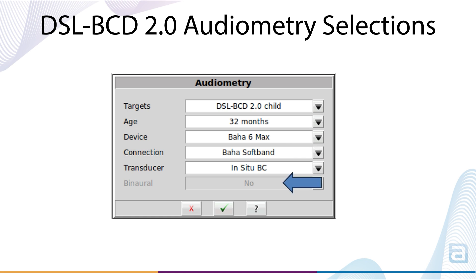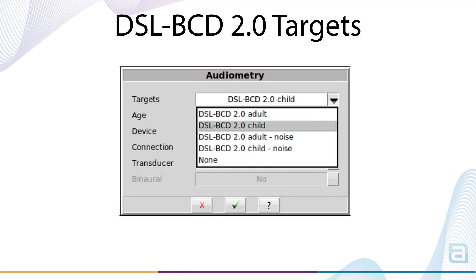Binaural is a summation factor which is only applicable to adult prescriptive targets, and it's the same as air conduction. DSL-BCD 2.0 target selections include adult, child, adult noise, and child noise. Noise targets are meant to provide listening comfort in louder situations and are not expected to improve speech recognition in noise, and none is available for instances where targets are not desired.